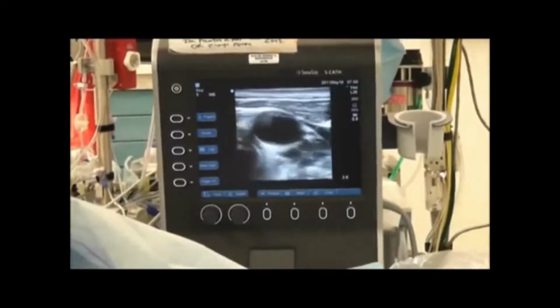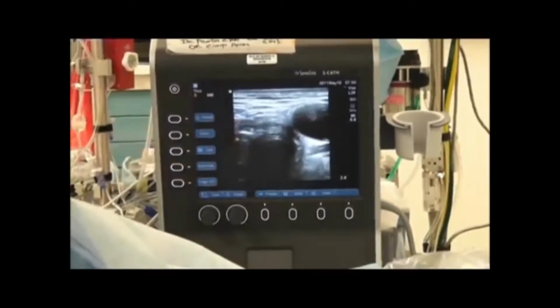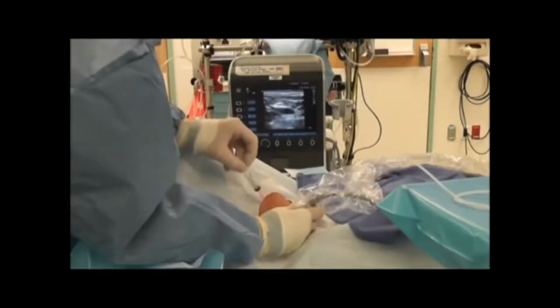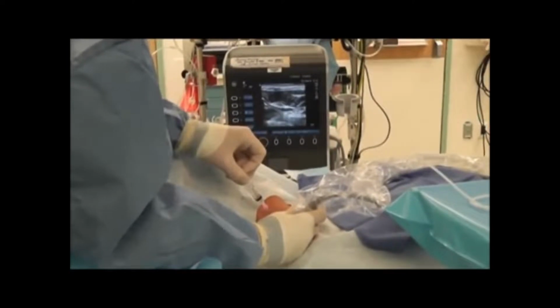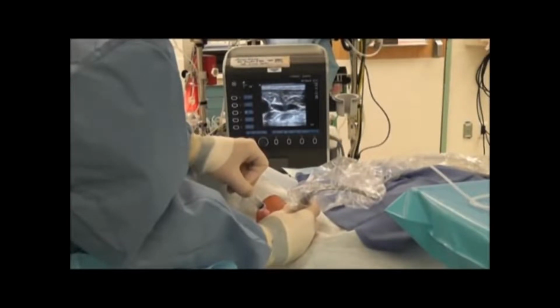And that's the artery, the carotid, and then the trachea. It's always good to examine. Again, more depth should have been used in this particular case. It's a video taken a few years ago, so I have enhanced my technique since then. You're following, again, the tip. My hand is moving the ultrasound probe so we can see the tenting in the anterior wall of the vein. And sometimes you have to push a little more.